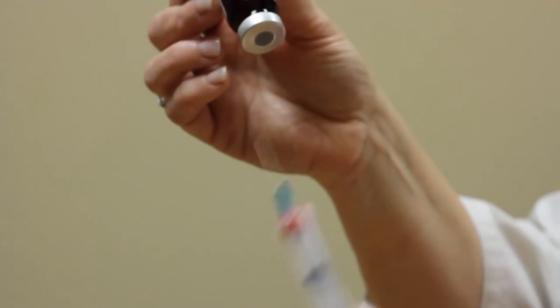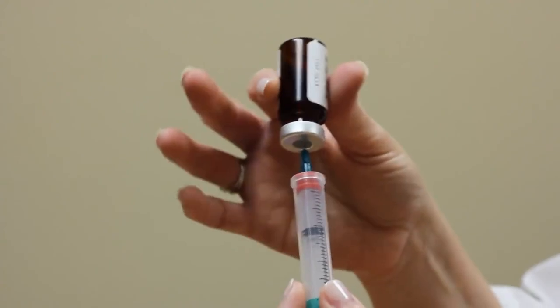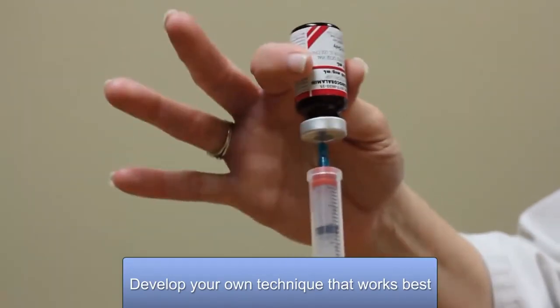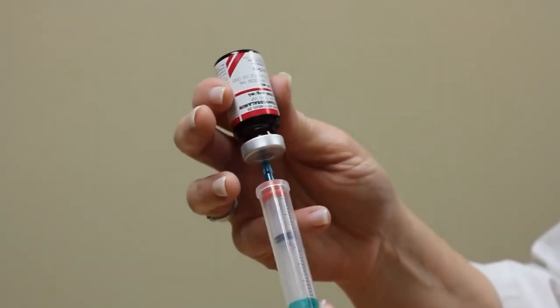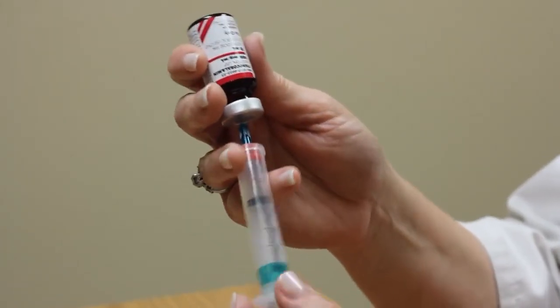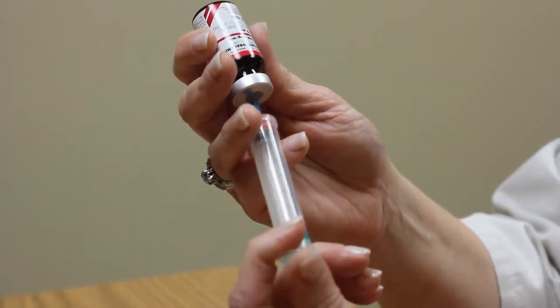You can leave the bottle on a clean, flat surface. Go ahead and inject the needle in through the rubber stopper at the top of the bottle. Each time you practice this, and the more shots you give, you will develop your own technique. You don't have to be exact on what I'm showing you — it's whatever you feel comfortable with for how you hold the syringe and the bottle. I'm going to take my dominant hand and push the plunger down, basically pushing the air into the bottle.